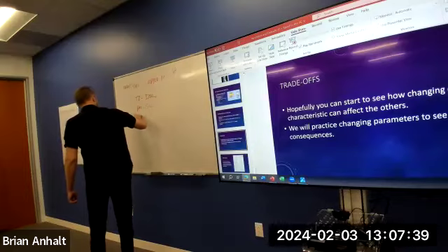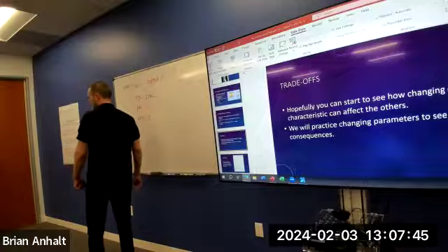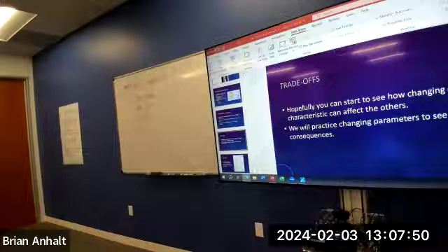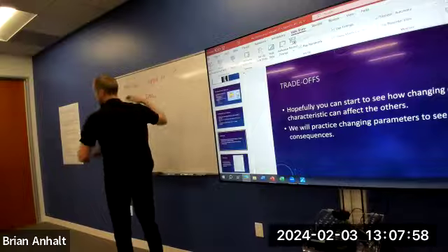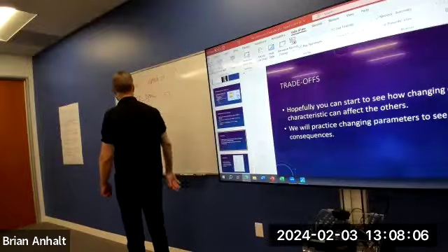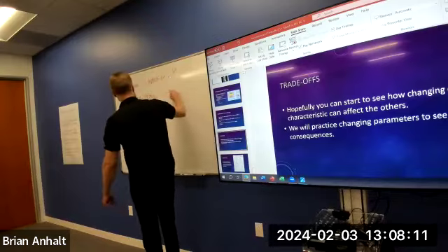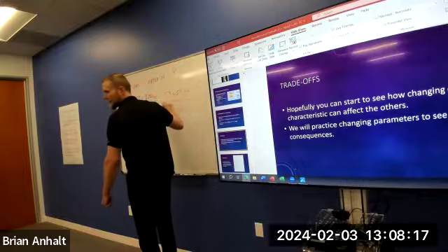What is my NEX, or averages? Two signal averages. And does it have an ETL? Yeah, 25. We'll talk about ETL in physics two. It's for fast spin echo, and I don't want to get into that yet. We do this first: TR times phase matrix times NEX, and then it's divided by your echo train length. This is 3.7 seconds, right? A second is 1,000 milliseconds, so you just divide by 1,000. 3.7 seconds times 512 times 2, all divided by 25? Yeah. Okay.